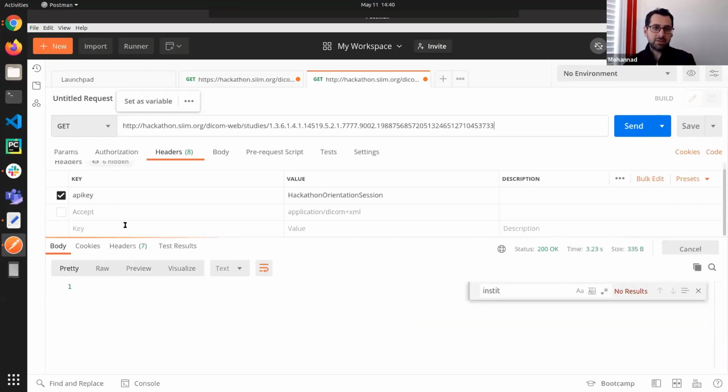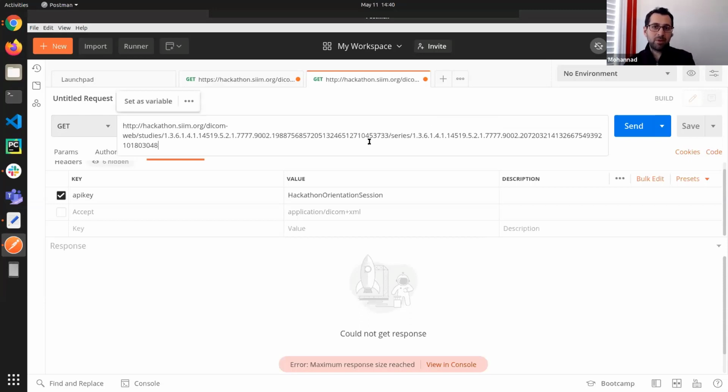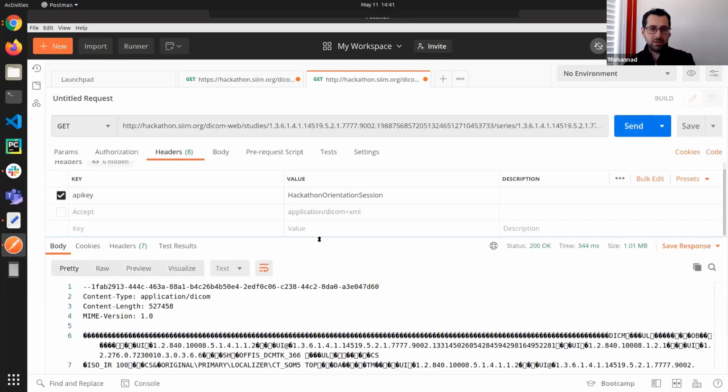Now, you notice, maximum response size reached. Okay, so the study I asked for was just a little too big. Let's do this at a smaller level. So I'm going to do this at a series level. Remember the hierarchy, right? So there is a study UID over here, and then I'm going to ask for a specific series, okay? So now I'm going to send this, and now you see the gibberish here.